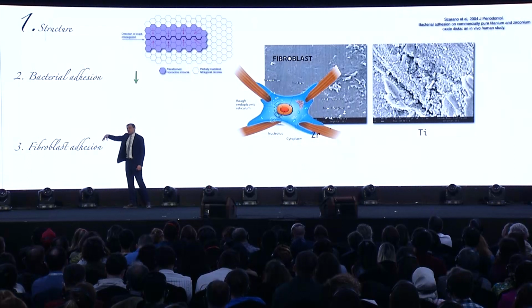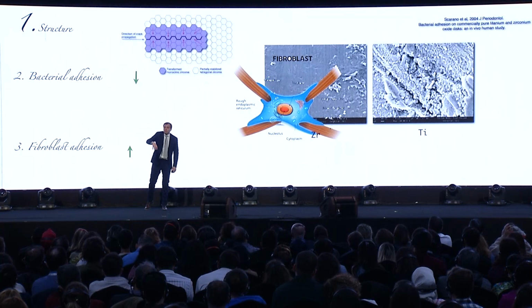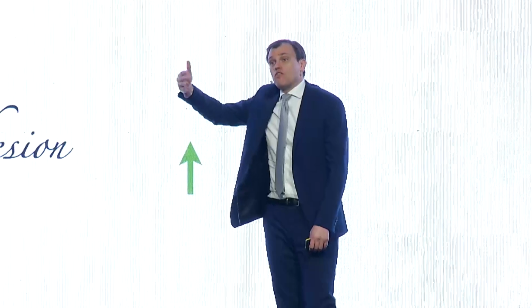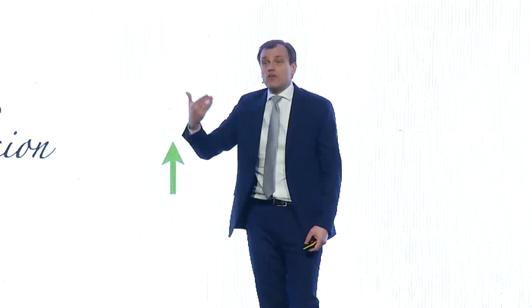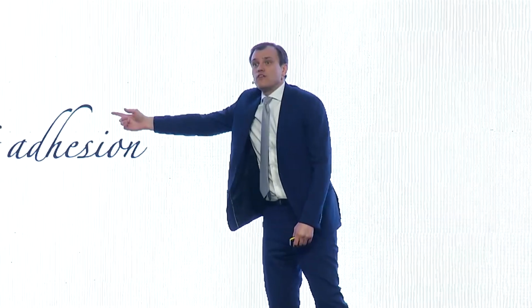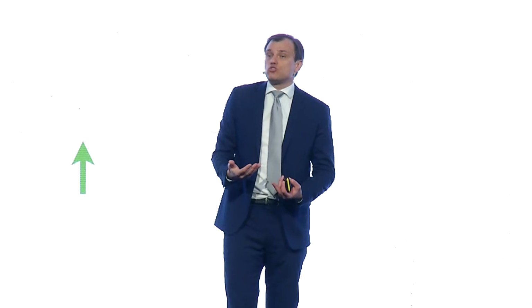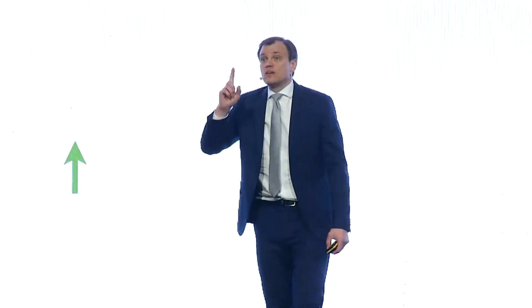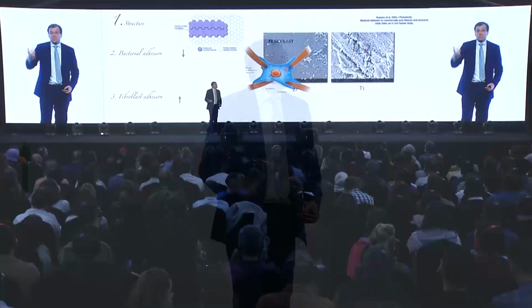When I put a Ti-base with zirconia restoration on the implant, there are no fibroblasts in contact with zirconia. So we might think, okay, why do we need all those studies if actually there is no contact between those materials when we place the implant? Now keep this in mind. I will come back to this statement in 5 minutes.